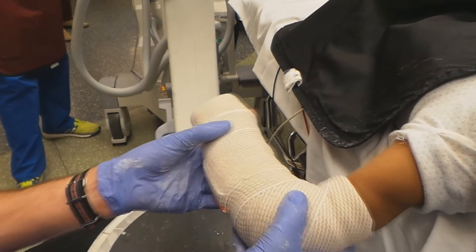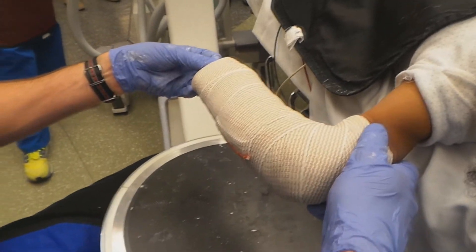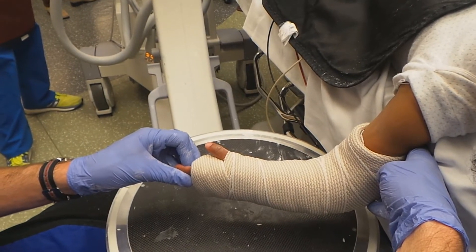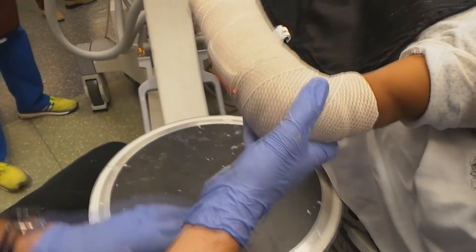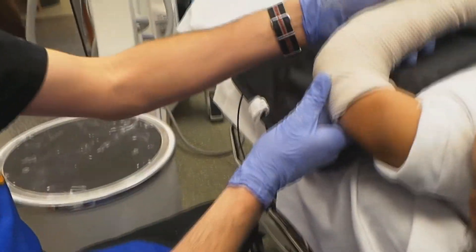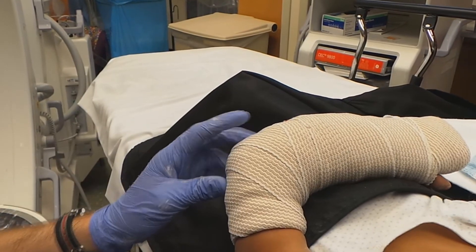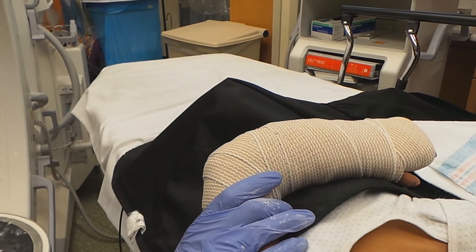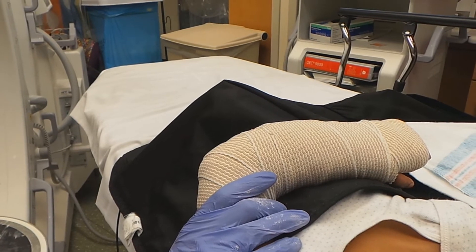All right, two more pictures — that should do it. Picture there. And picture there. Excellent alignment there. At this point, just keep the elbow at 90 degrees and put pressure at the fracture site for a good interosseous mold as the plaster sets up. And that's all there is to it. I want to thank mom for letting us do this video — she knows it's going to end up on YouTube, but you'll have final say on it. We'll take some post-reduction films and if all looks good, she can head home after that.